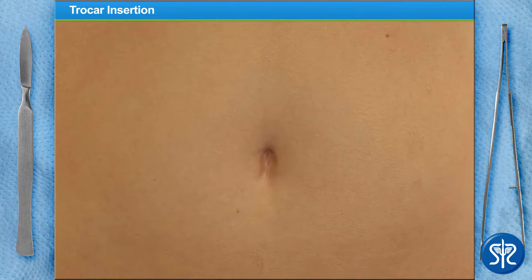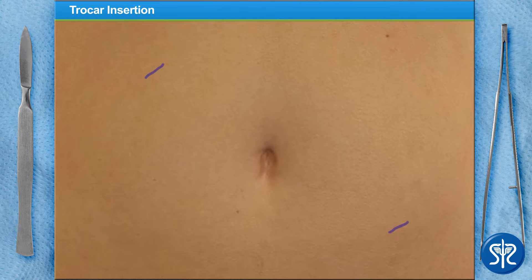We'll begin by making one small incision in her upper abdomen, one in her lower abdomen, and one in her navel, also known as the belly button.